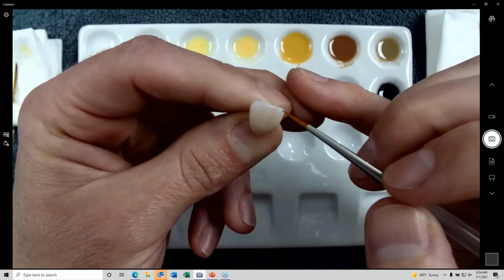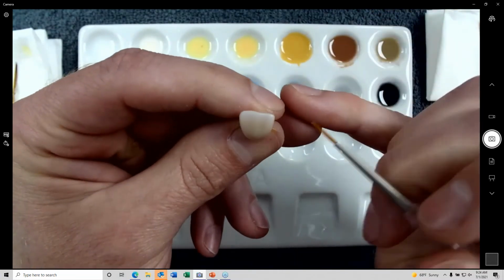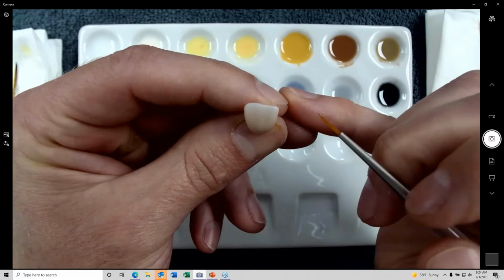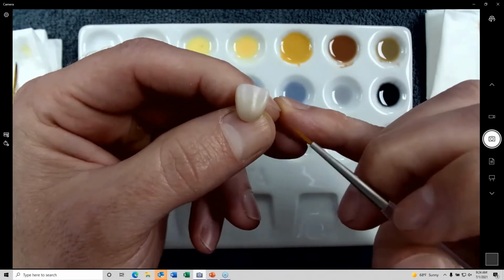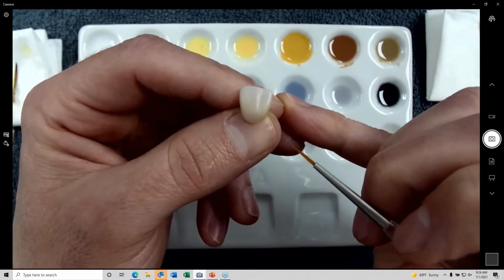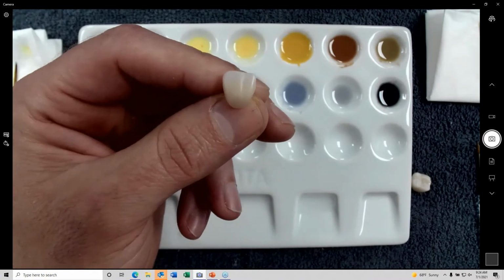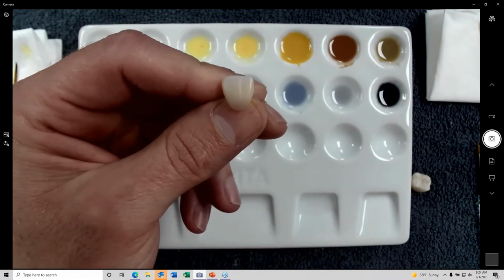And that is from, well, this was a pre-shaded one, but we added some of that blue on the incisal to give it some of that effect, and a little bit extra chroma down here to give it that effect. All right, and then we're going to go ahead and finish dialing in exactly the way we want it with our stain and glaze.